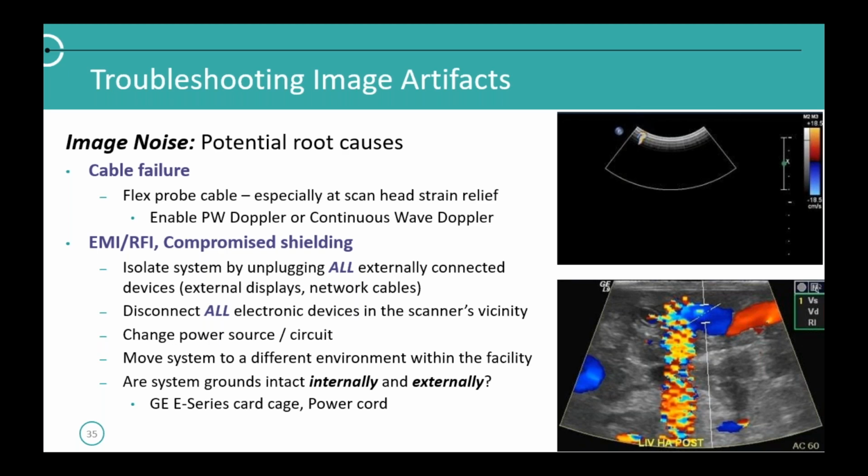I had an issue for several months. There was a microwave oven a floor above the scan room. It only acted up during break times because that's when people went to it. So it wasn't all the time. I chased this problem around, and only when I eliminated possibilities did I actually find the problem. So these types of problems are pretty much addressed through a process of elimination.